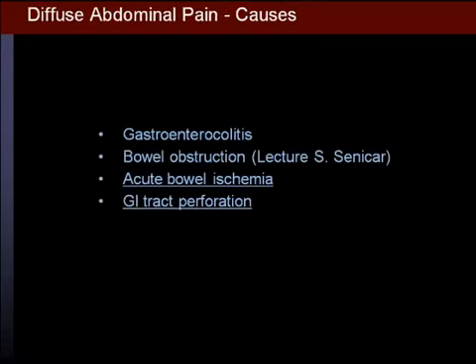From localized pain, I'm moving now to diffuse pain. And the most common causes of diffuse pain are gastroenterocolitis and bowel obstruction. But once again, this topic has been covered yesterday by this excellent lecture of Dr. Senica. I will only focus now on acute bowel ischemia and GI tract perforation.